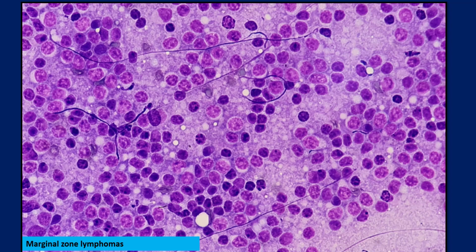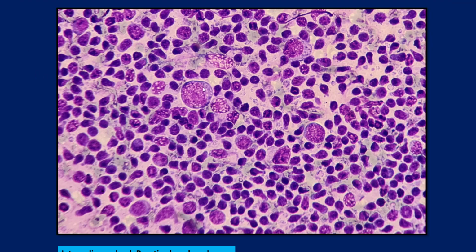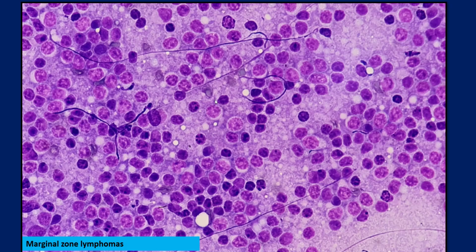What I'm worried about is the fact that sometimes the entire lymph node may not be involved, and you may find areas which look just like this. Then you move to another part of the smear or to another smear, and you see something like this. Whether it's because of smearing or whether it is truly a semi-monotonous population of cells, I really don't know. But when I see something like this in any part of the smear, I start getting worried.